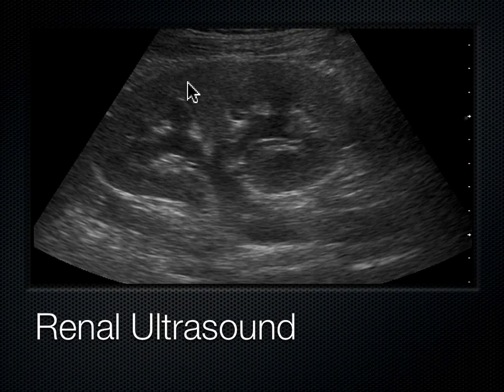Coming in from the capsule, we have the cortex. This material back here, this very isoechoic material here, is the cortex of the kidney. This is where all the nephrons are. And the nephrons take the blood that's coming into the kidney through the renal artery, they filter it, and they send the blood back to the rest of the body through the renal vein, and they take the blood and they filter out the urine and put it here in this pyramid.